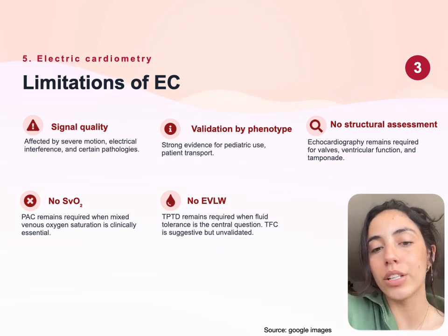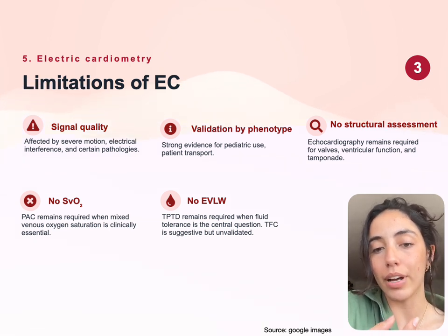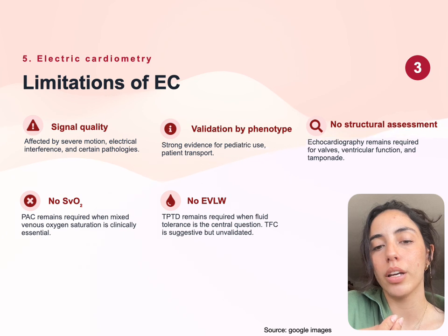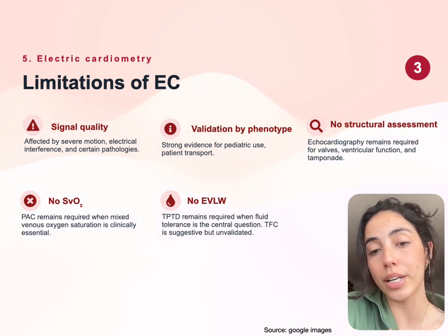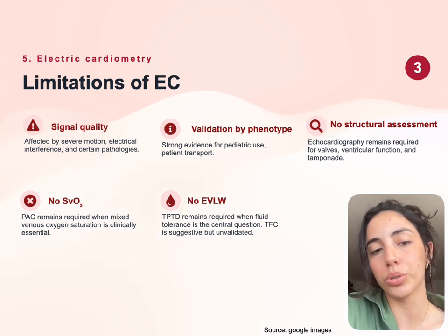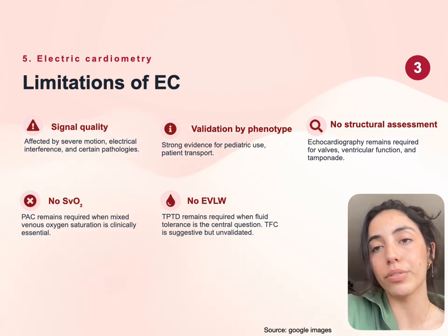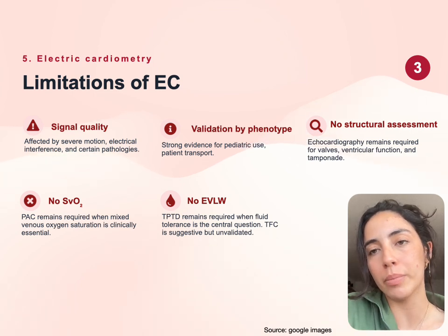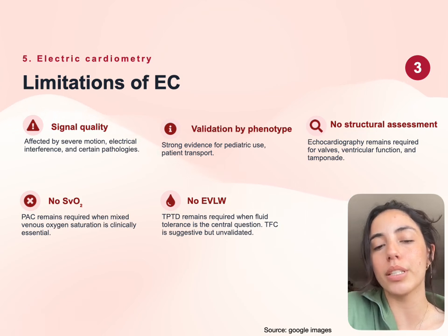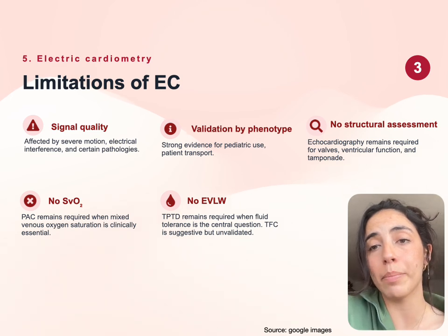And finally, even though, as I previously mentioned, TFC is a value that is going to provide us a rough estimate of the intrathoracic volume content, it's not the same as what we gain through transpulmonary thermodilution. Essentially, TFC is a global parameter and it's a non-specific index for thoracic fluid. It's going to go up with pulmonary edema, however, it's not going to be specific, as it's also going to go up with pleural effusions and hypervolemia, and also patients that have obesity, for example.